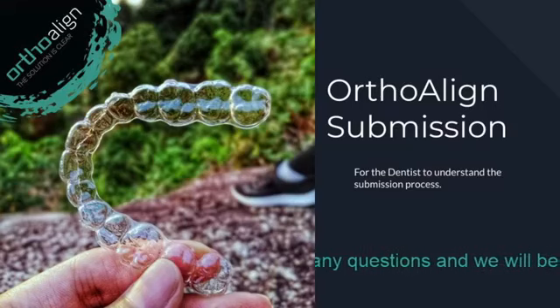Okay, what we have here as well is an example where the capture of that last molar was not fully captured. If this does happen, our orthodontist will only be able to plan from the first molar and not this molar over here. So it's very important that you do manage to capture all the way, capture the entire distal wrap.